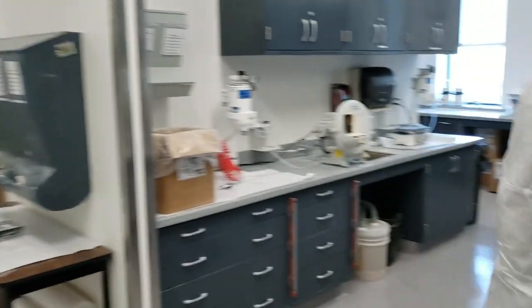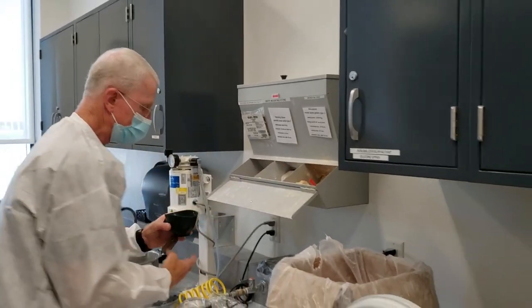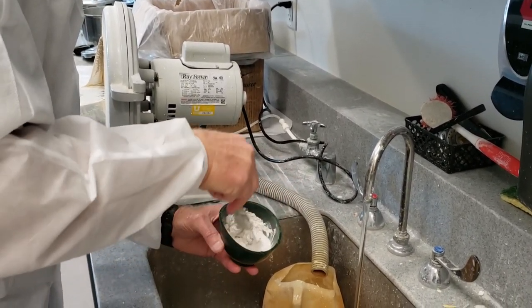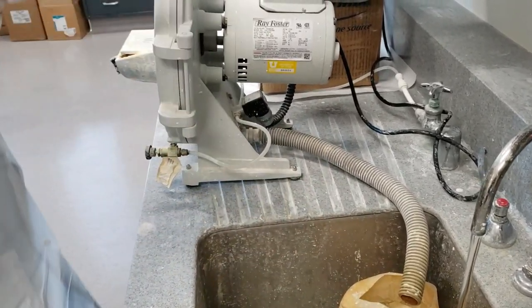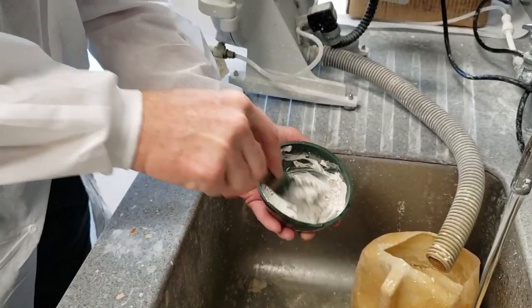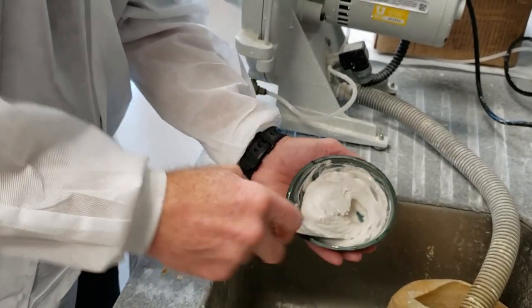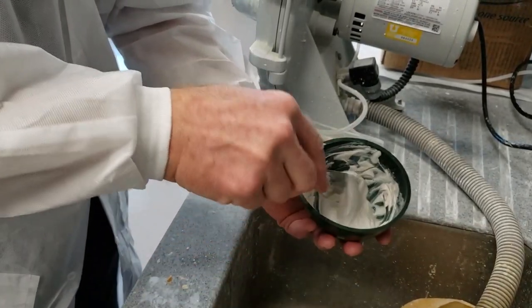Let's go mix up our stone — we'll need a little bit more than last time. I'm going to use a couple of scoops and maybe a half. I overdid it just like last time, so let's add a little bit of powder. If it's very runny, especially with a pretty good gap to fill, you'll end up with mounting stone all over the place. It needs to be at least a moderate consistency or a little thicker — but this will work fine.